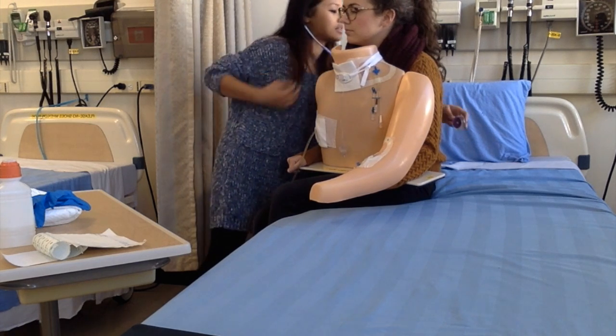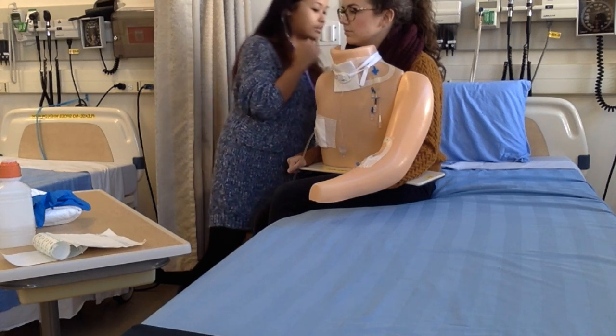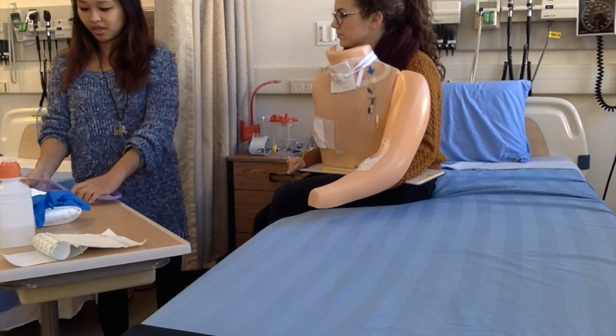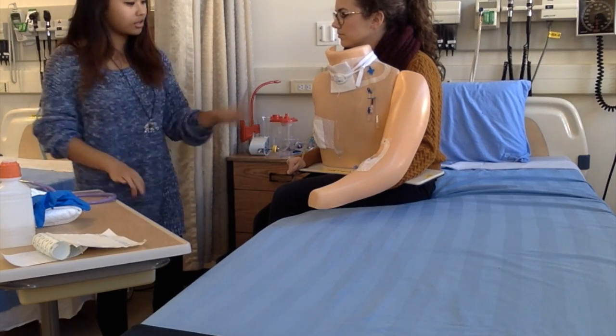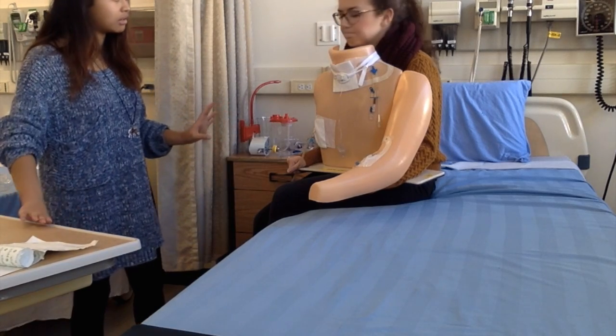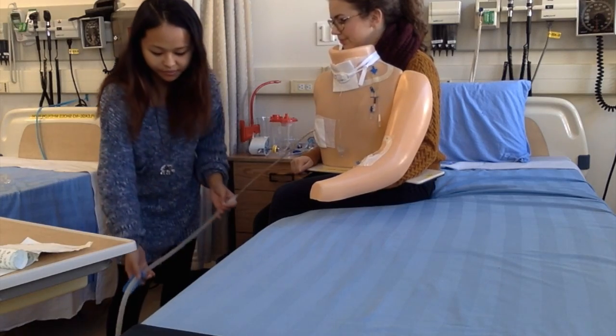Okay, I'm just going to reach around to the side here. Don't mind me. Good. Alright, so everything seems pretty normal as usual. And I'm just going to check a look at your connection. Did you notice any hissing sounds or anything? Anything weird? Alright, no holes.